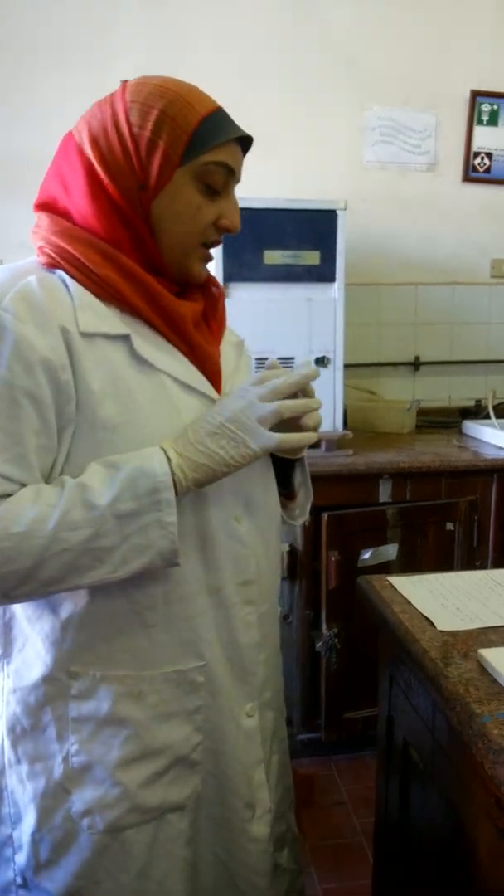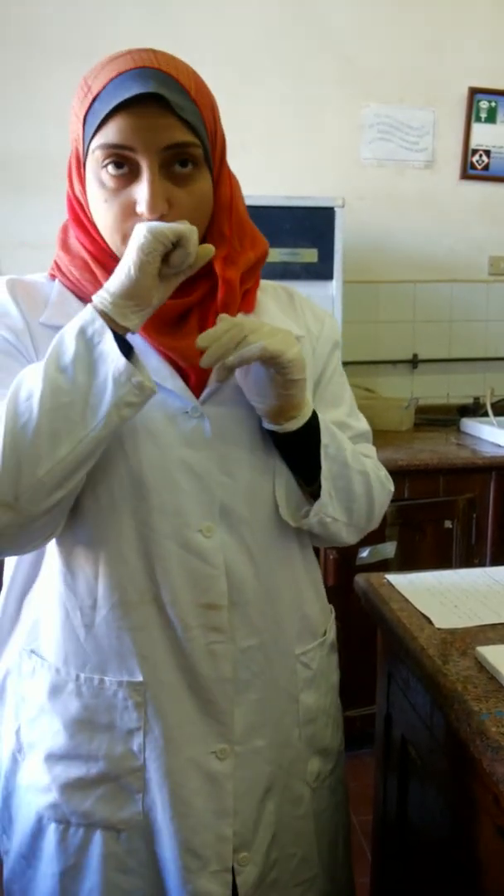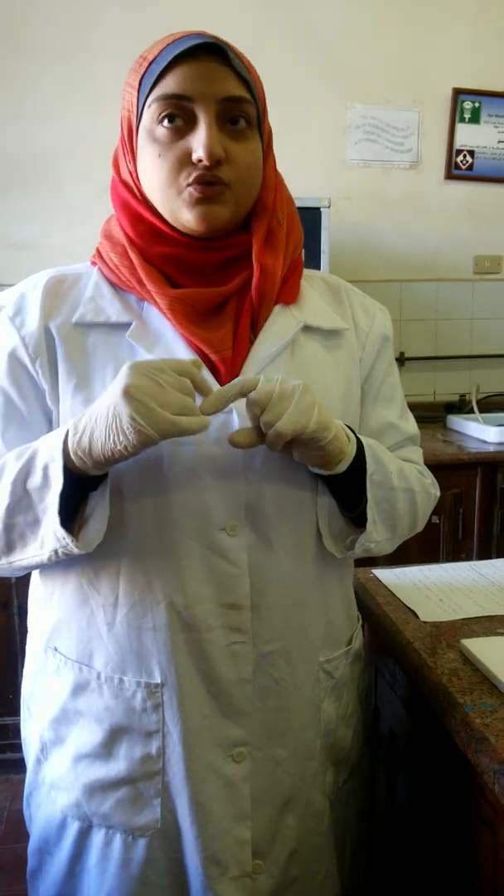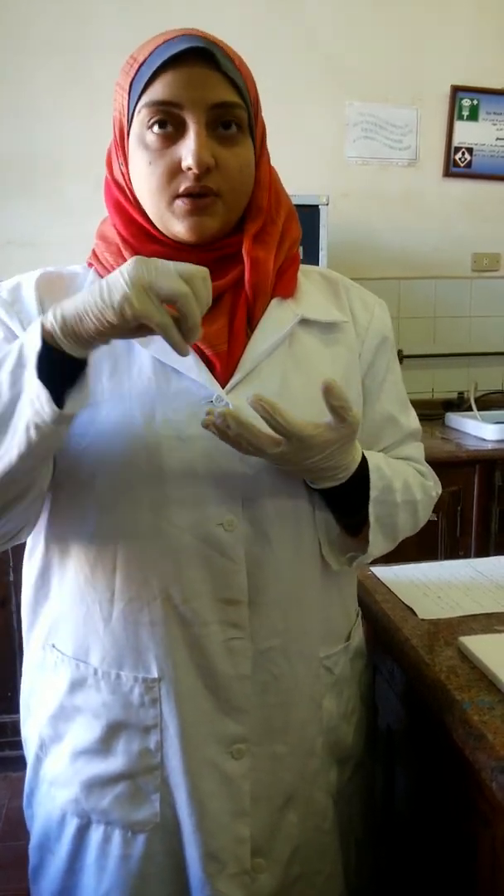First, we are going to choose a female rat weighing over 150 grams. We must ensure that she has given birth at least once or twice, and we prefer to use one who gave birth recently.